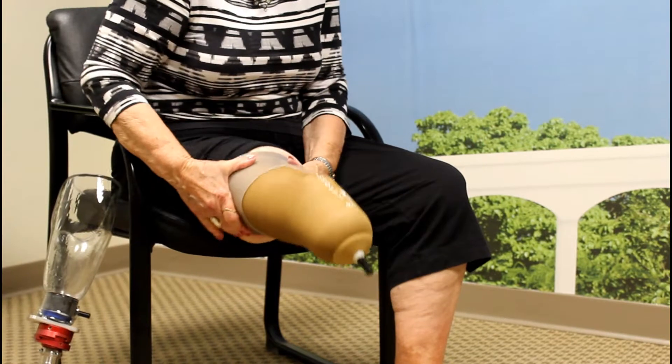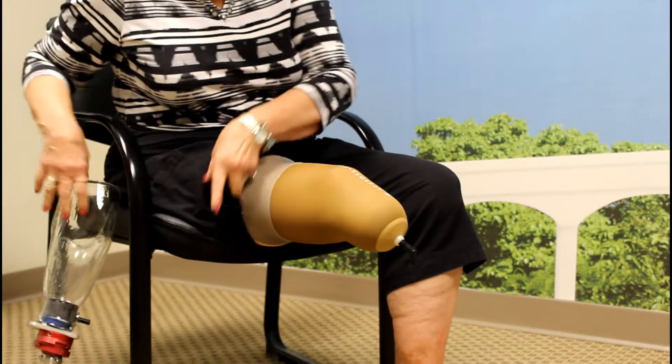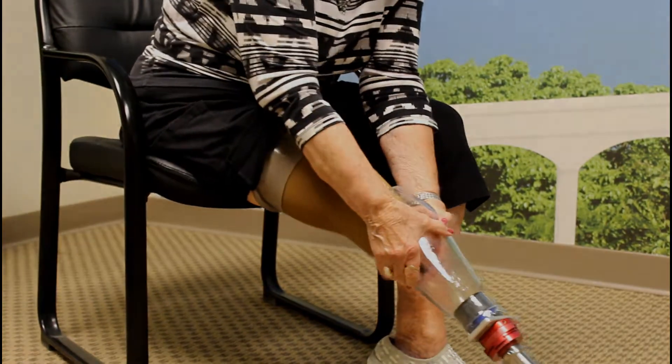The liner should extend above the kneecap several inches. Excess liner can be trimmed by your prosthetist if desired. Next, make sure the pin is in line with your leg and place your limb in your socket.